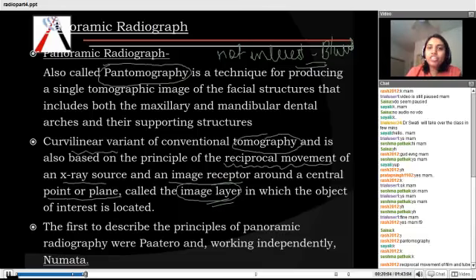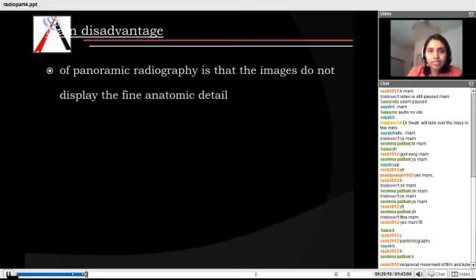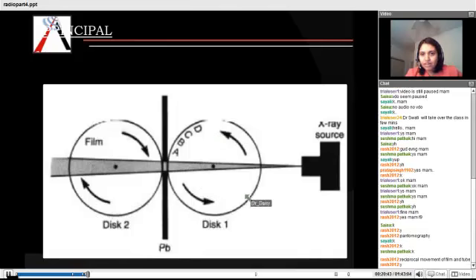Right. Initially, when the principle of panoramic radiography was given, it was something this way. Let's see how it goes. Here you have disc 1. This is our X-ray source, and on this side we have a film. Now if we rotate the film in this direction and rotate the disc, wherein we have these radio-opaque objects A, B, C, D, supposedly, we are rotating this in this direction.